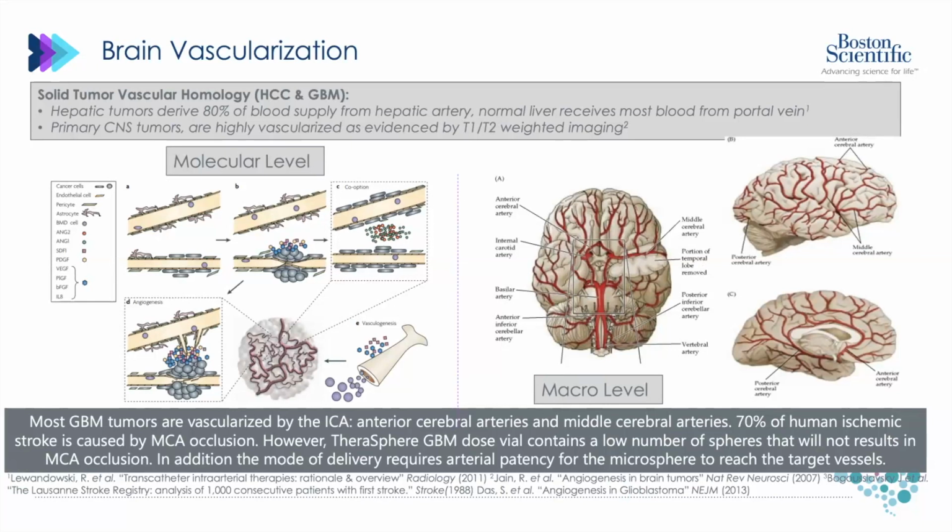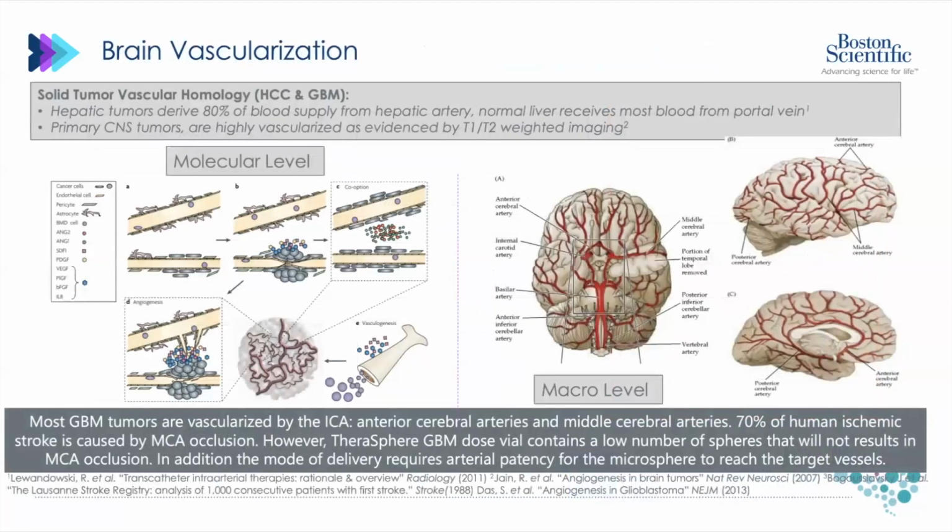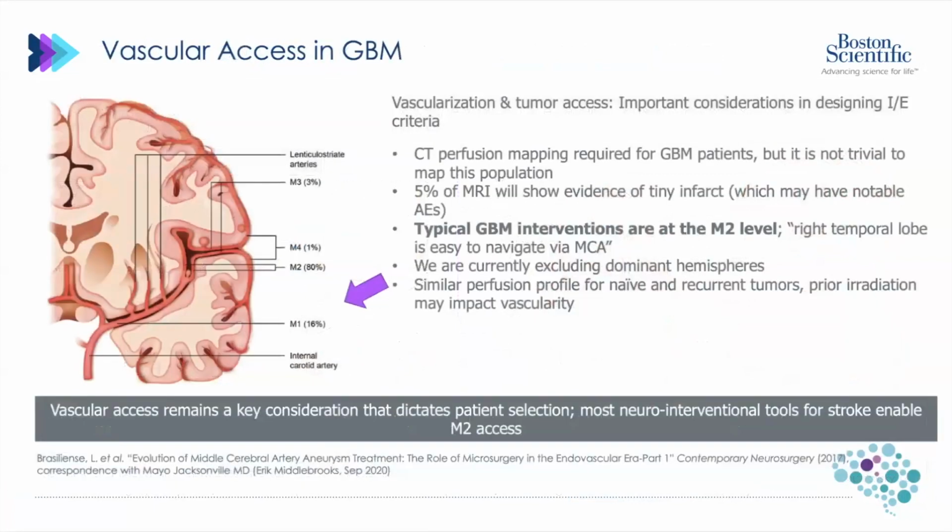But this is kind of the microvascular setup of the basic blood-brain barrier, which we talk about astrocytes, pericytes, and all of the growth factors involved with tumors. So what you will be doing is vascularizing and putting microcatheters in this distribution to deliver these spheres.